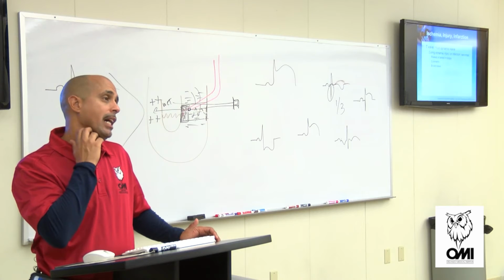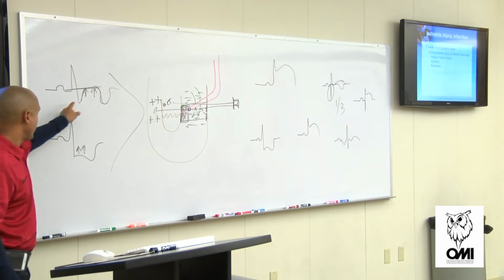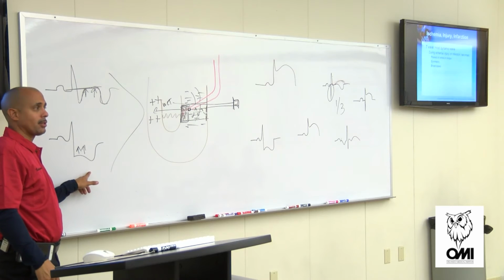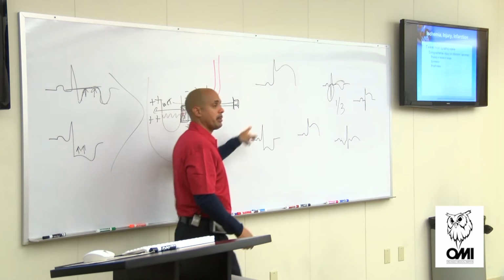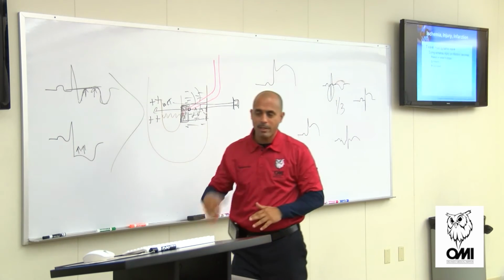The T wave is the most dynamic wave. You know what they mean? It's constantly going different ways on the isoelectric line, right? It's downwards when it comes to ischemia, then it could be upwards, then it could be downwards here. It's normally upwards, so it's very dynamic.